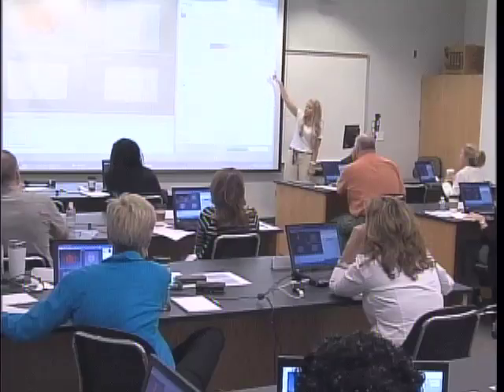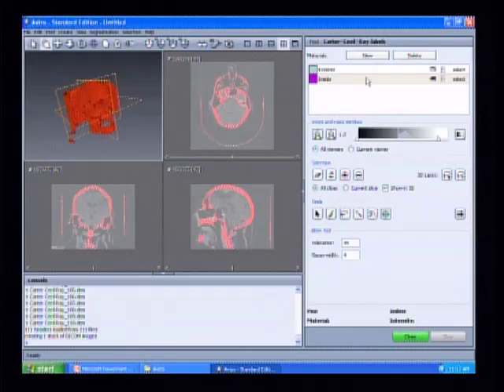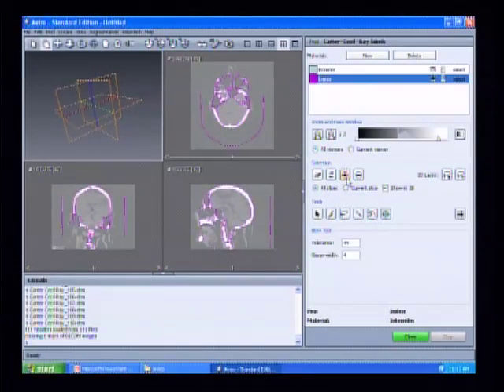Are we all okay here? You'll see that inside in your materials is already selected. It's highlighted. If it's not, you just have to click on it. We want to add this to what we're just going to call the inside material. You can go ahead and hit the plus button, and it will change to the color of that material.